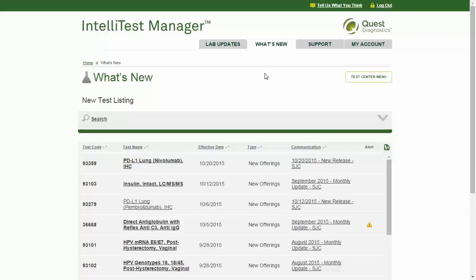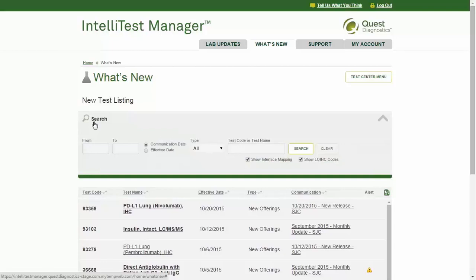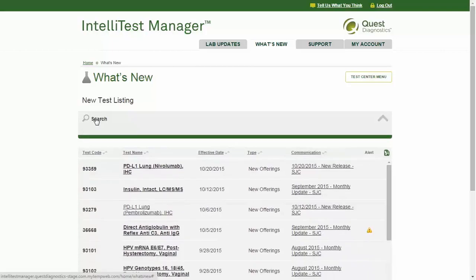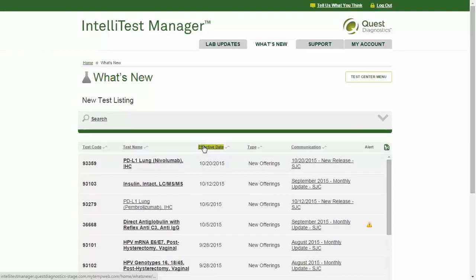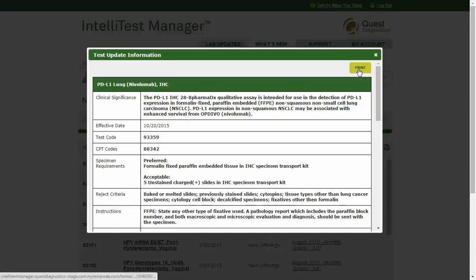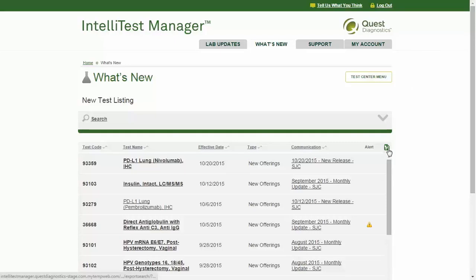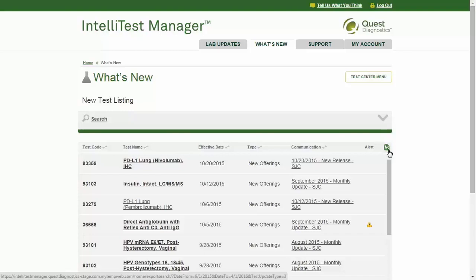The What's New tab provides a simple way to learn about Quest Diagnostics' new test offerings. This list displays all new tests introduced within the past six months. The Search section can locate new tests communicated prior to that six-month range or search for a specific test. The list includes the test effective date and a link to the original communication. Click on a specific test to view or print the full details. You can export this list via the Excel icon, and there is also a link to open the Quest Diagnostics Test Center to access the full test compendium.